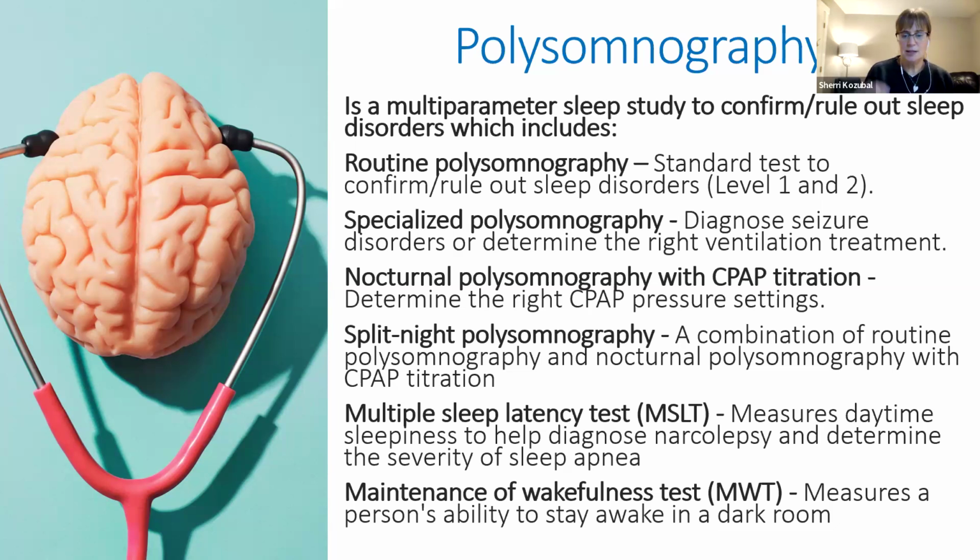And then, of course, the maintenance of wakefulness test, or MWT, which measures a person's ability to stay awake in a dark room. That one can be challenging for a lot of people in general, but we have specific criteria where we'll see sleep disorders in these certain circumstances.